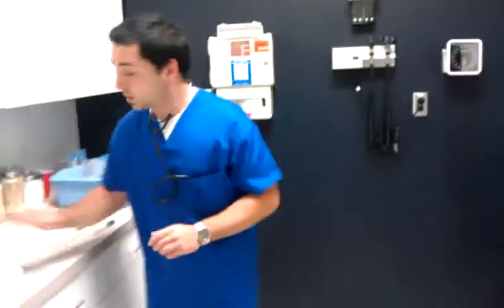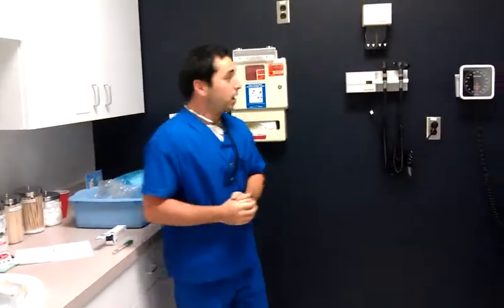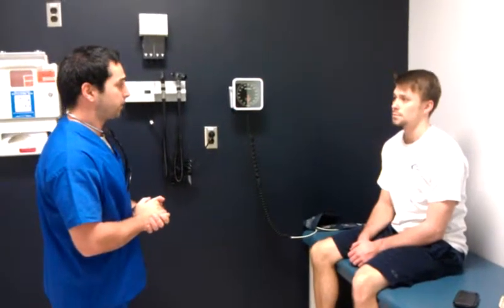First I walk in the room, wash my hands, make sure my hygiene is clean. Hi, my name is Brian McCallion. I'm here as a Liberty nursing student. I'm here to assess you for your vital signs. May I ask you for your date of birth?